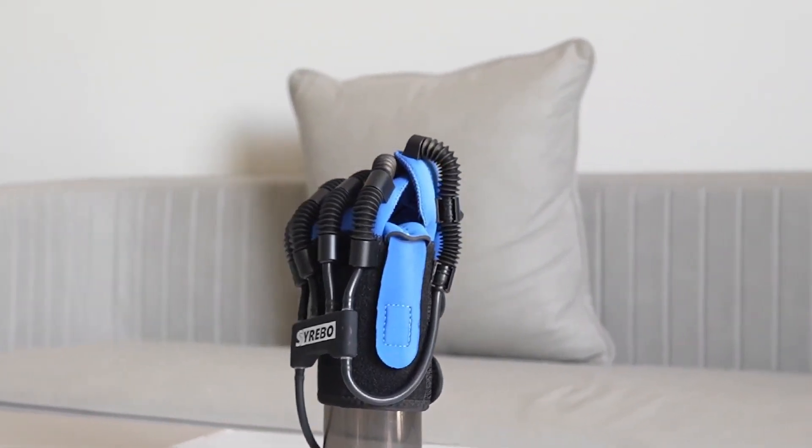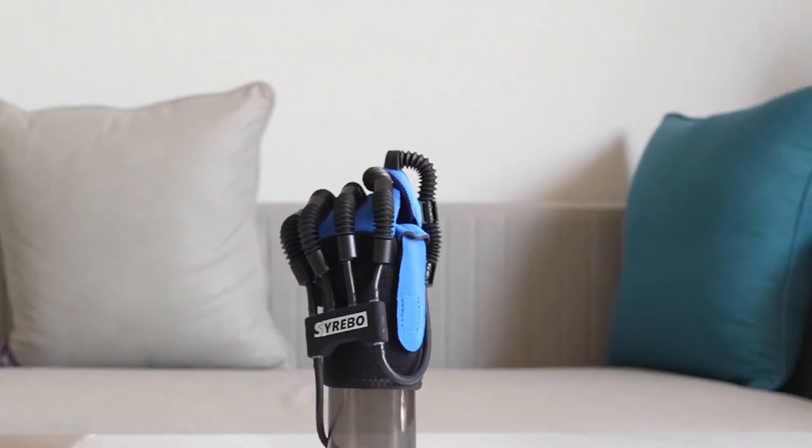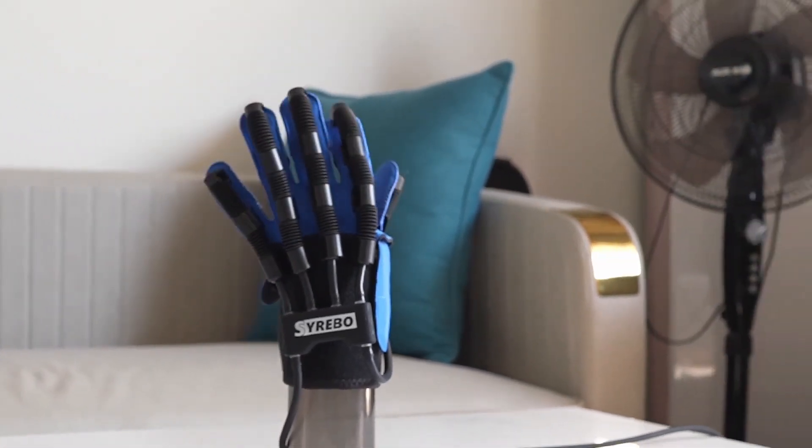In this video, I'm going to show you how the SmartGlove works, what benefits it offers, and how it can change the future of stroke recovery.